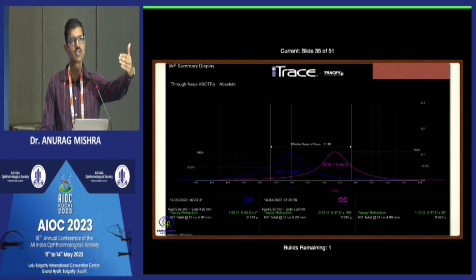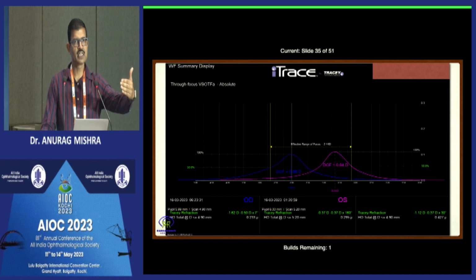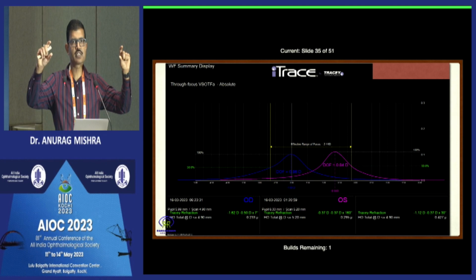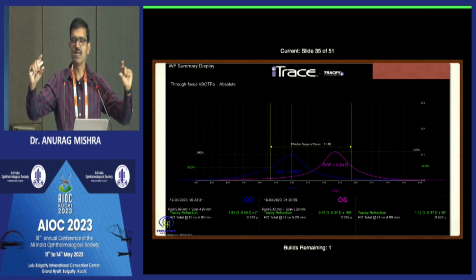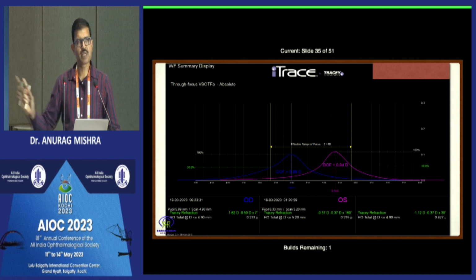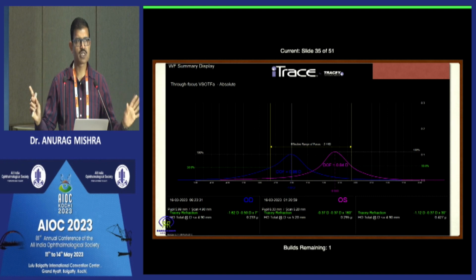He has very good distant vision. He has very good intermediate vision. He has very good near vision as well, because the range of focus extends to 2.5, almost normal. Bilaterally, he has received another trifocal IOL, which is not from Hoya. But the patient is very happy. I have no complaints against the patient, who does not complain of anything.